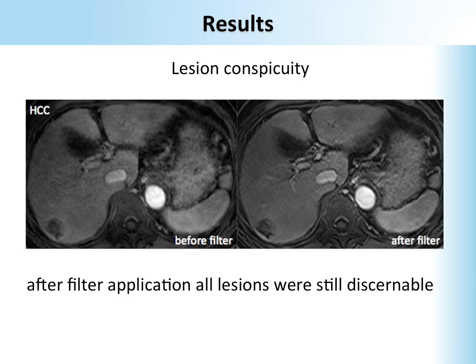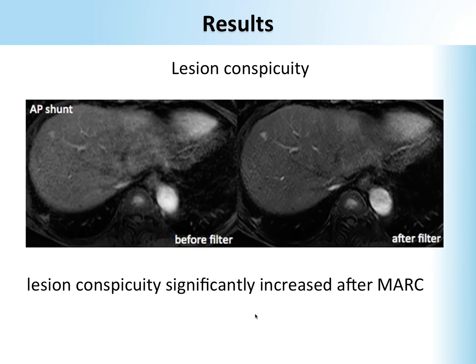So you can see before filter, after filter, the hepatocellular carcinoma, which you can see here in this lobe, it's much better discernible because the artifacts were reduced.